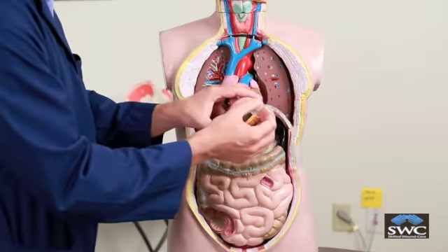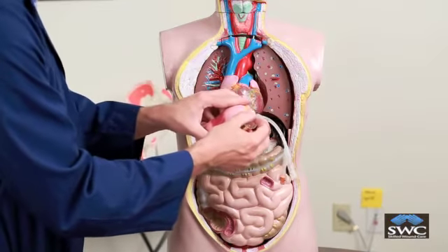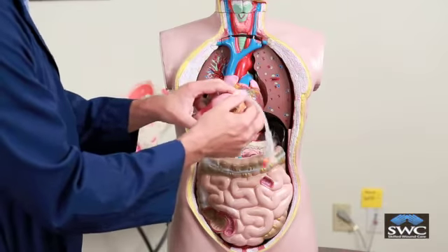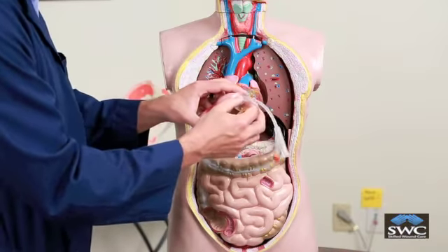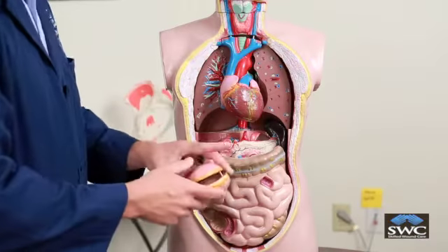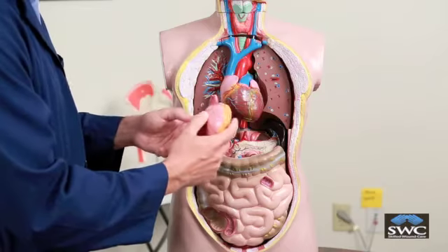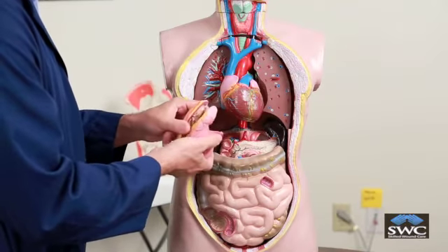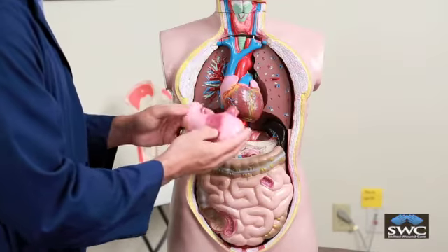Now, we are a surgical service, so we can change these tubes in the facility. However, if you would like to change them on your own, we recommend knowing exactly what kind of tube you are putting in, and we highly don't recommend doing this, in case of that 1 in a million case where you put it in the wrong site and you don't actually replace it in the patient's stomach. It's almost inexcusable.